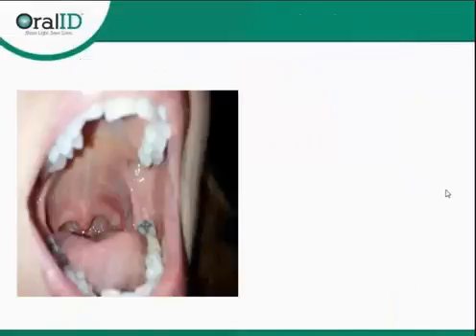So it's not just about finding cancer. Here's another scenario. This was a hygienist whose office had newly bought our device, and they were playing around screening each other, which is something we recommend you do. When you get your device, screen each other, make sure everybody's nice and healthy. Also practice taking pictures at that time, so you work through the troubleshooting, and when you take images on your patients, you've already worked out the kinks.